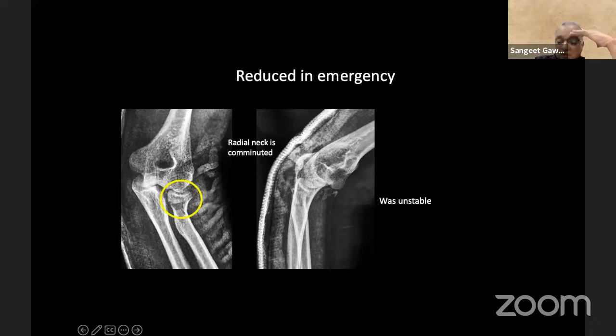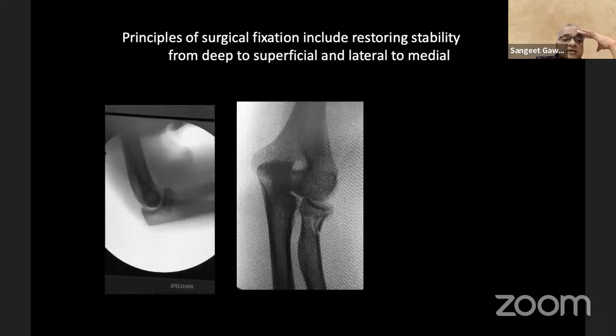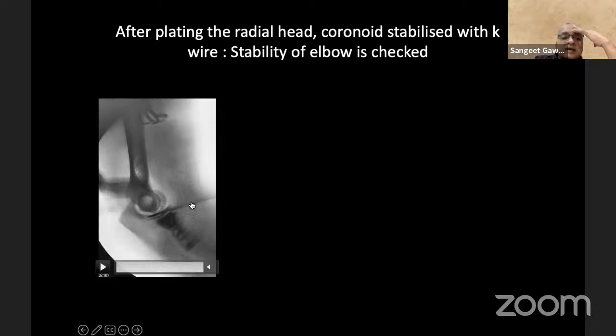And this is his CT, where you can see the coronoid fragment is a large coronoid fragment from the anterolateral side. Okay, there is a comminution of the radial metaphysis. There is no radial head fragment, but the neck is comminuted. And you can see, so this is reduced, but in extension, it dislocates. So this is how it was closed reduced. And then the radial head was fixed and the coronoid fragment was fixed by a K-wire. And we did a range of movement.